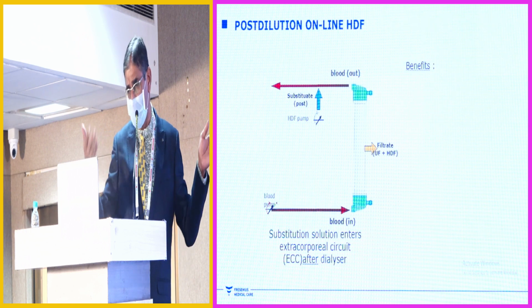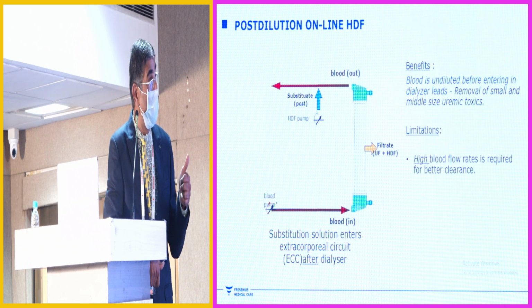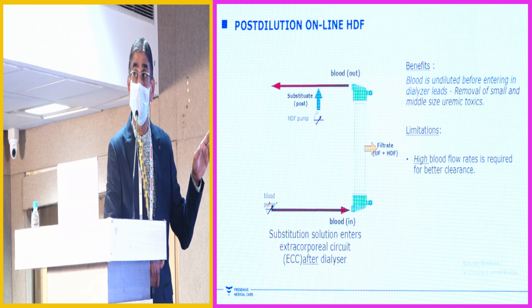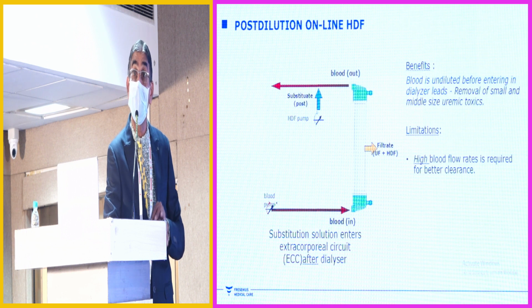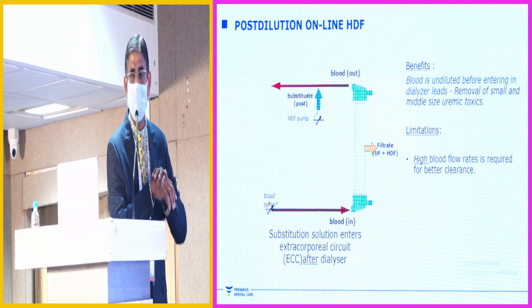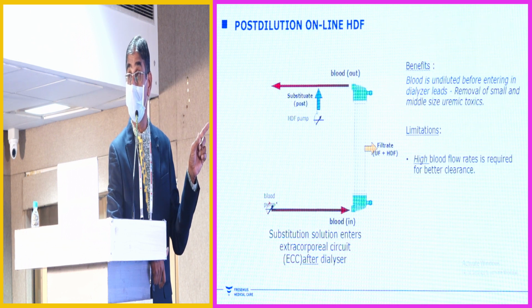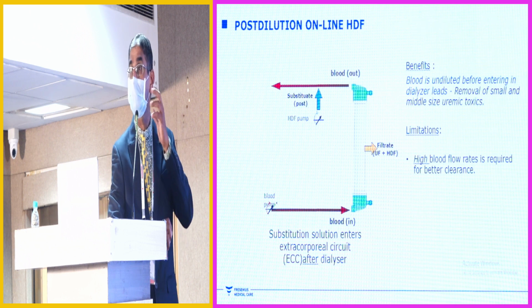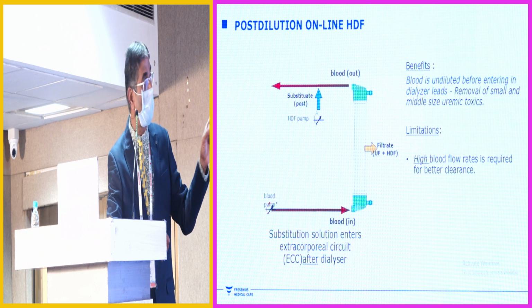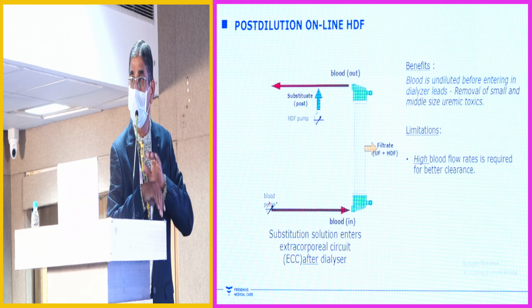Post-dilution, I think most of the people sitting here would have seen only post-dilution, which is with heparin. The clearance I have seen is amazing. In the last 5 years with one of the units, I have seen even wound healing in a patient. A lot of medications were given to that patient, but I found that because of this hemodiafiltration, the patient's wound got healed. I'm telling you this in the name of God. I don't know, probably some of the things which were preventing the wound from healing have been removed.